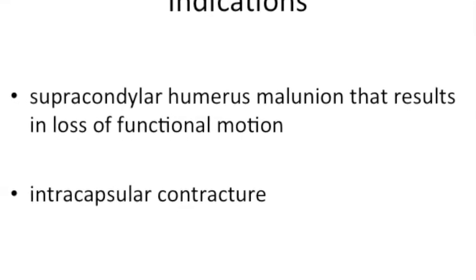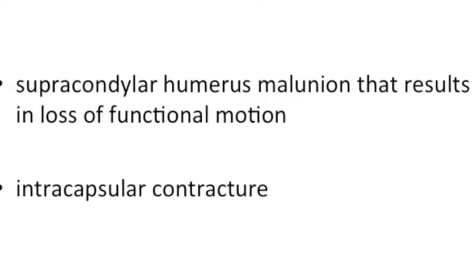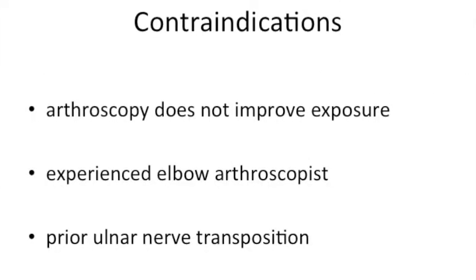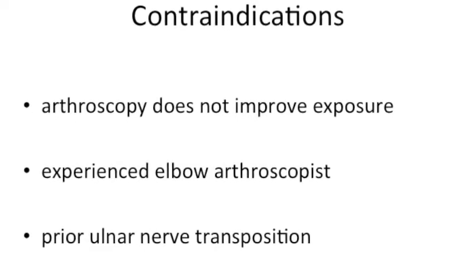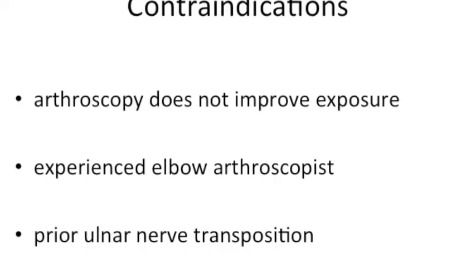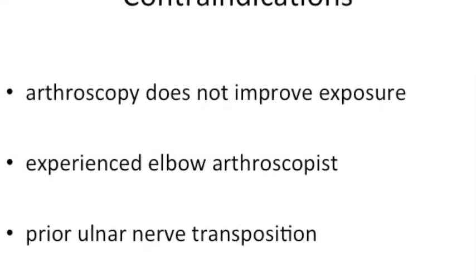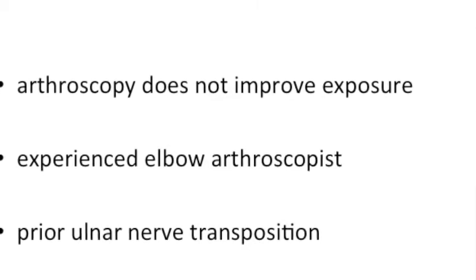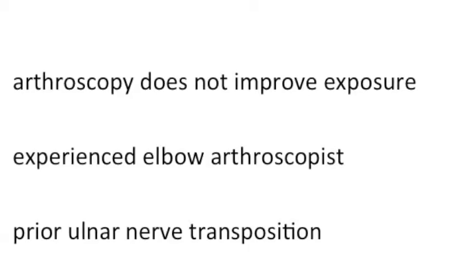In addition to addressing bony malunion, this approach affords the surgeon the opportunity to address an intracapsular contracture concomitantly. Contraindications for this technique revolve around exposure. If arthroscopy does not improve exposure, the procedure should be abandoned in favor of a traditional open osteotomy. Also, this approach demands an experienced elbow arthroscopist, comfortable with pediatric elbow arthroscopy. Lastly, if there has been prior ulnar nerve transposition, we find that elbow arthroscopy is generally contraindicated.